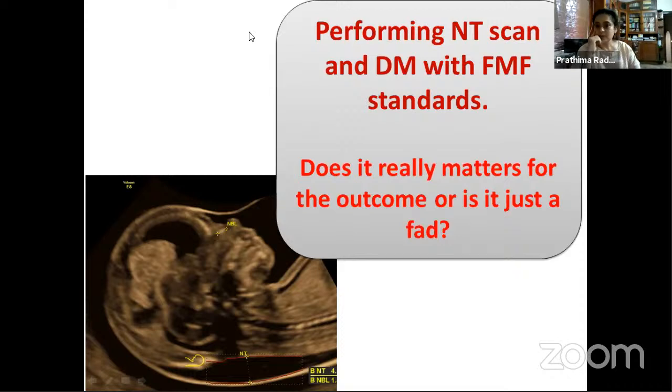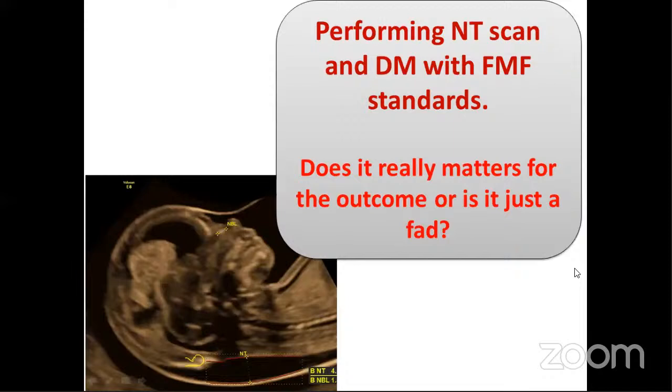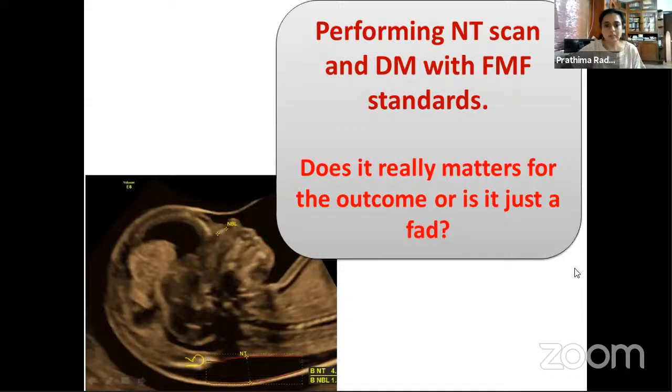So it is absolutely an important thing that you must follow standards. Now, why FMF standards? FMF was the first one to come out with these kind of standards, and the whole world follows the FMF standards, and therefore FMF standards. It's as simple as that. It's got nothing to do with any personal organization or anything like that, because we know that NT was there before Kypros published his paper in the late 90s, but he was the one who standardized the whole thing, and there is no debate on what should be there.